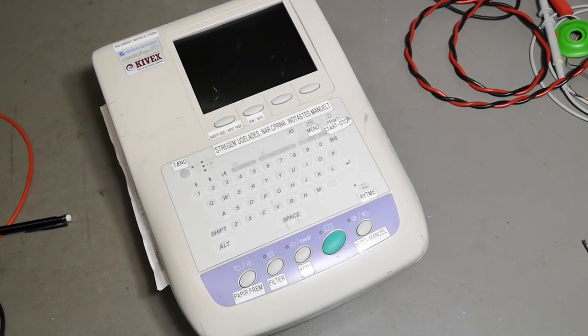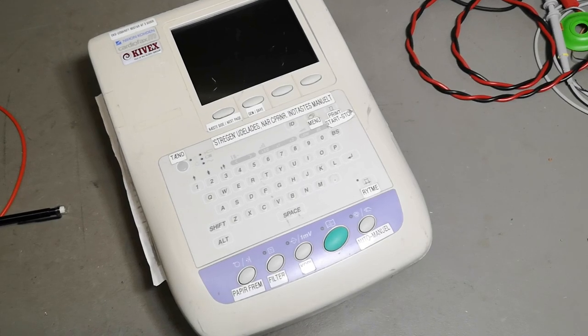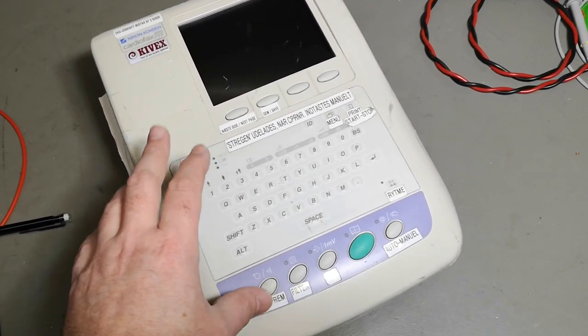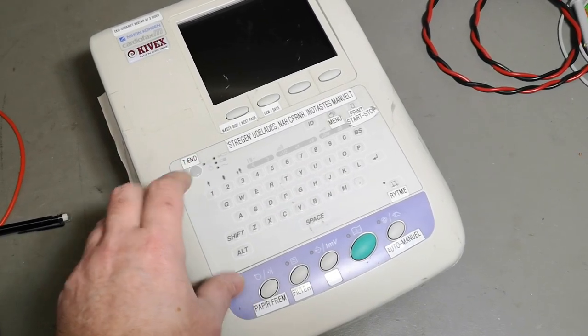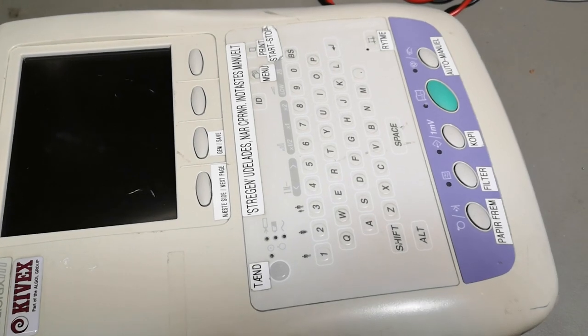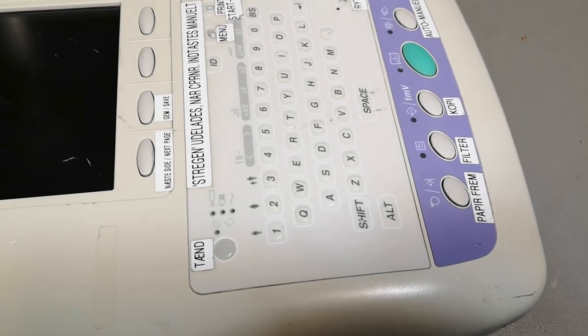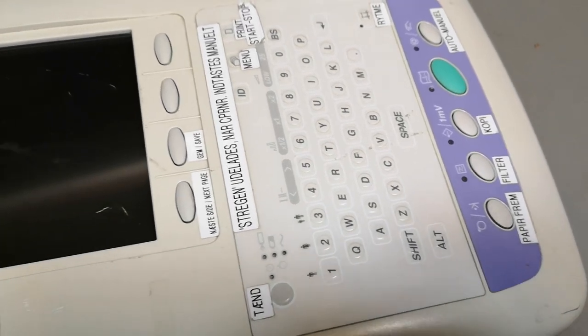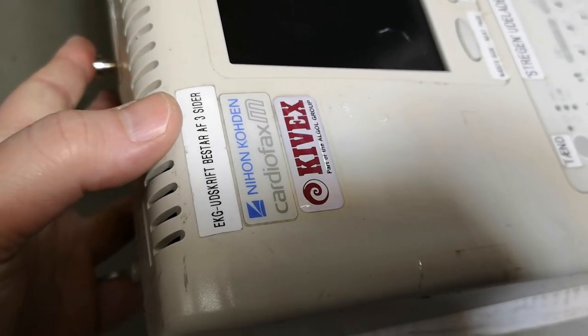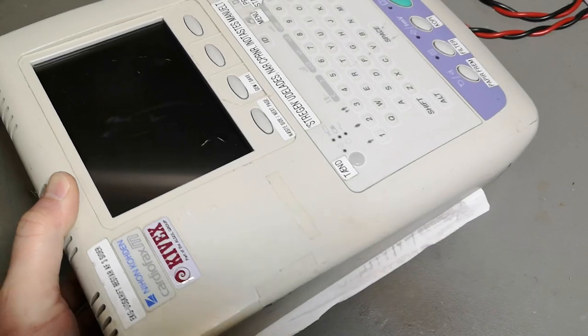Welcome to a new test and teardown video. This time it's a medical product — an electrocardiograph. Cardio means heart, so this one is doing heart curves. As you can see, it's been used by Danish nurses who didn't really want the difficult menu system, so they added menus of their own to make it faster and easier to use. There's even a note up here that says the printout is three pages, and there is definitely also a thermal printer in this unit, which is quite impressive because it's not that big.